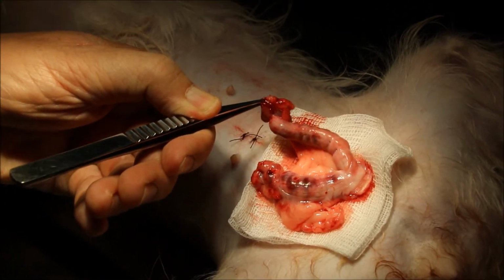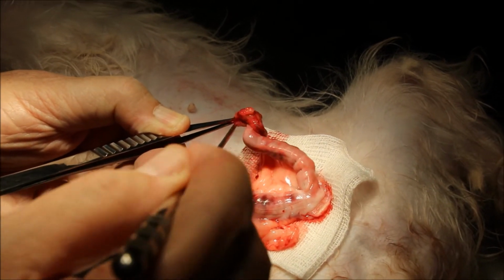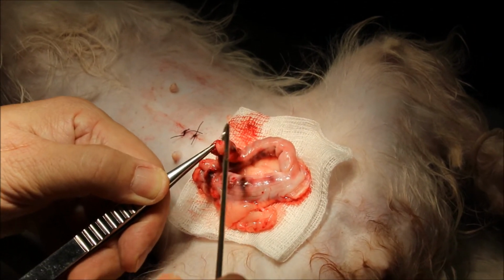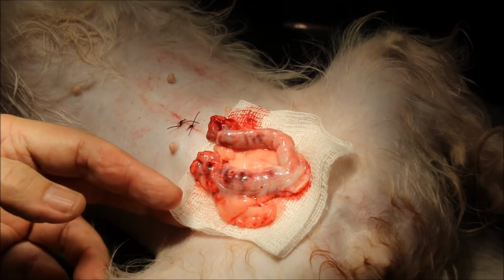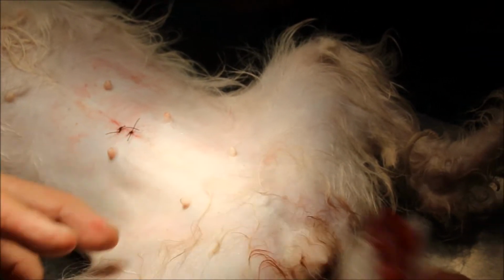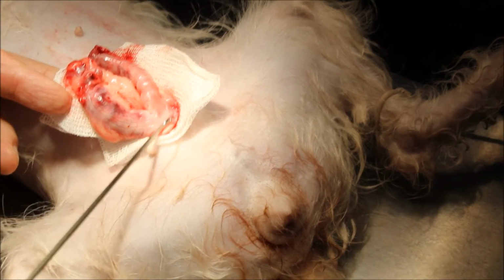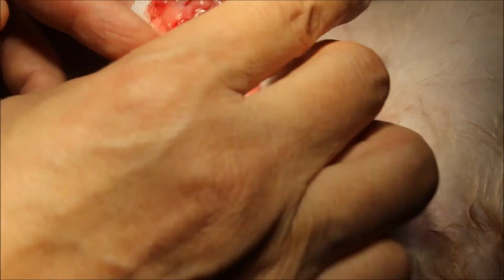The ovary might just break because you keep pulling, and some pieces might drop inside. If there's any ovarian tissue left, then you have problems already, because the dog will come on heat again, and that is called stump pyometra. Sometimes the dog or cat will start to have infection at an older age, and this infection will come from here. They call it stump pyometra.